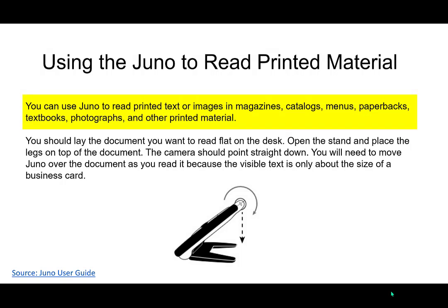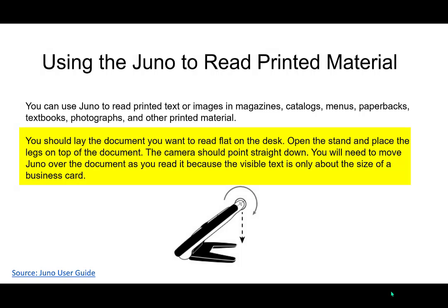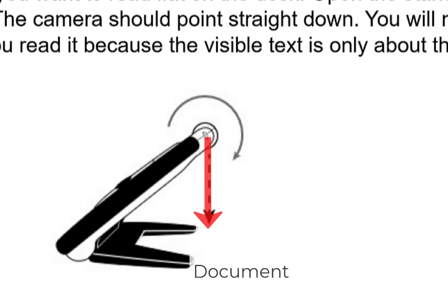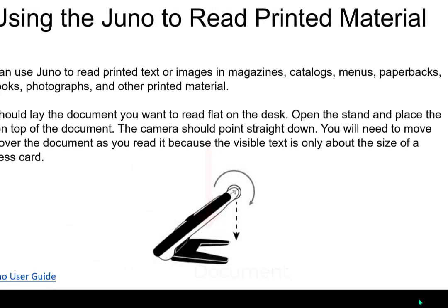To read printed material like magazines, catalogs, things like that, paperbacks, textbooks, you're going to extend the stand and the camera is going to be put down. You need to lay the document or the item down, lay it flat down on the surface or as flat as you can get it. And you're going to need to put the legs on top of the document. The camera needs to point straight down. And because the camera does not move right or left, you need to physically move the unit across the material that you're reading. So that's kind of important to know.